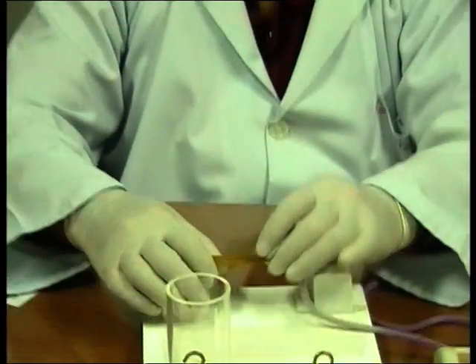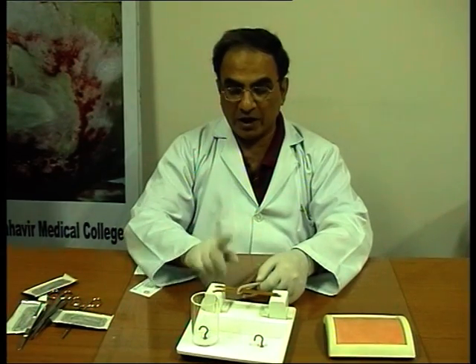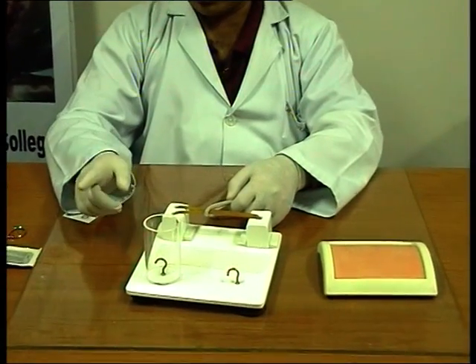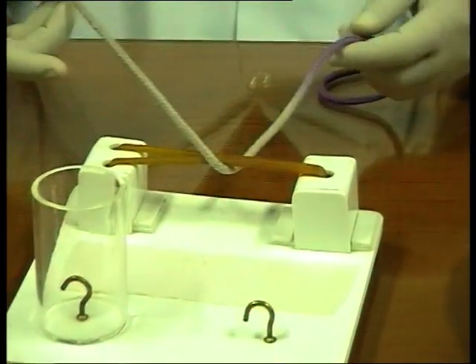Is it clear? Now I'll just show you once again and then you'll put it. This is one way of putting the slip knot. Why do I always show this method? This also reinforces the fact that when you're putting a knot, you will always cross. There are many other ways of putting a slip knot. See, I'm showing you again.